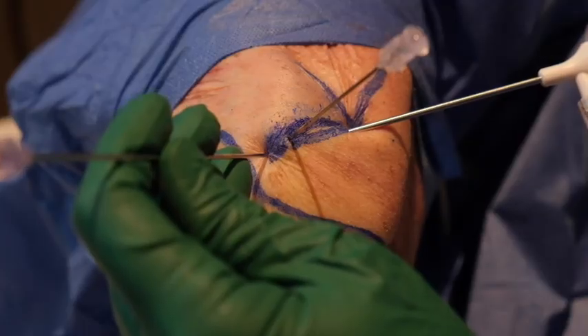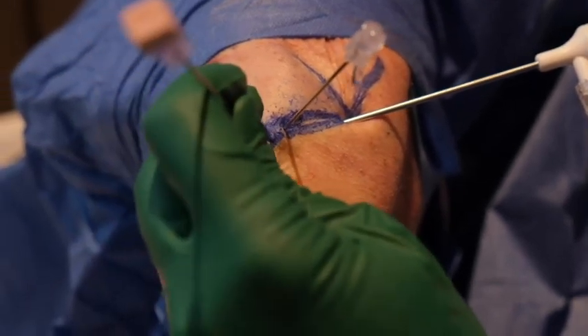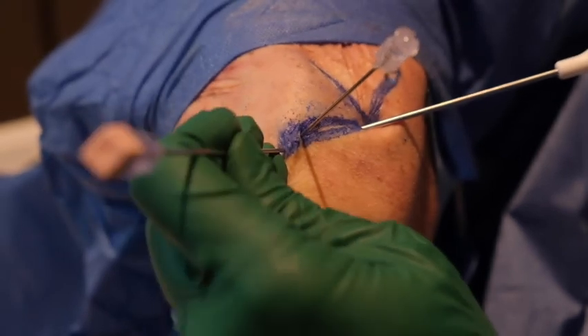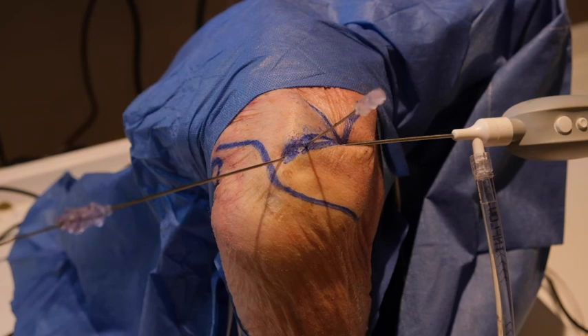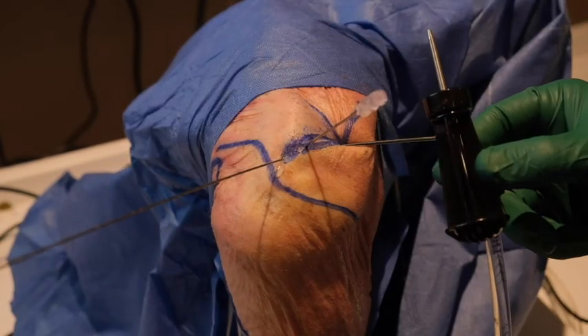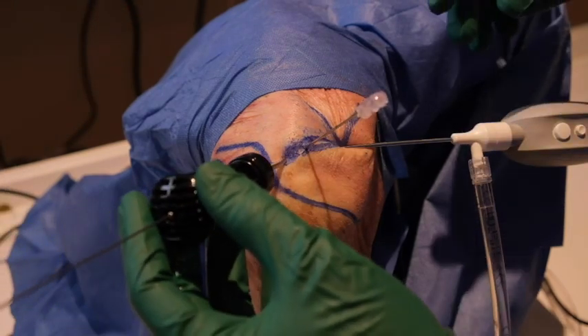The anterior portal is created just anterior, direct in line with the acromioclavicular joint, also without a scalpel, but using an outside-in technique. A spinal needle is inserted into the joint at a 30 degree angulation caudally and visualized by the nanoscope. A nitinol wire is inserted into the needle and the needle is removed. A small cannula is then inserted over the wire and the wire is removed.